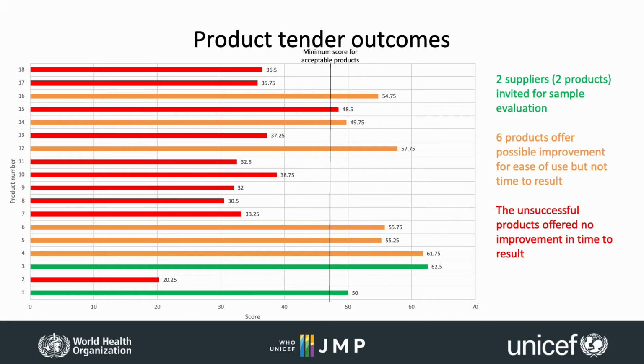We also recognise that culture-based processes can only get so fast. But the lab validation also allows us to better understand the timings and the use cases, recognizing that it's never going to be one water quality testing product that's going to suit all situations. Understanding how they perform in the lab under different challenges gives us a greater understanding of how the products perform, so we can better advise each use case and colleagues towards the right products.